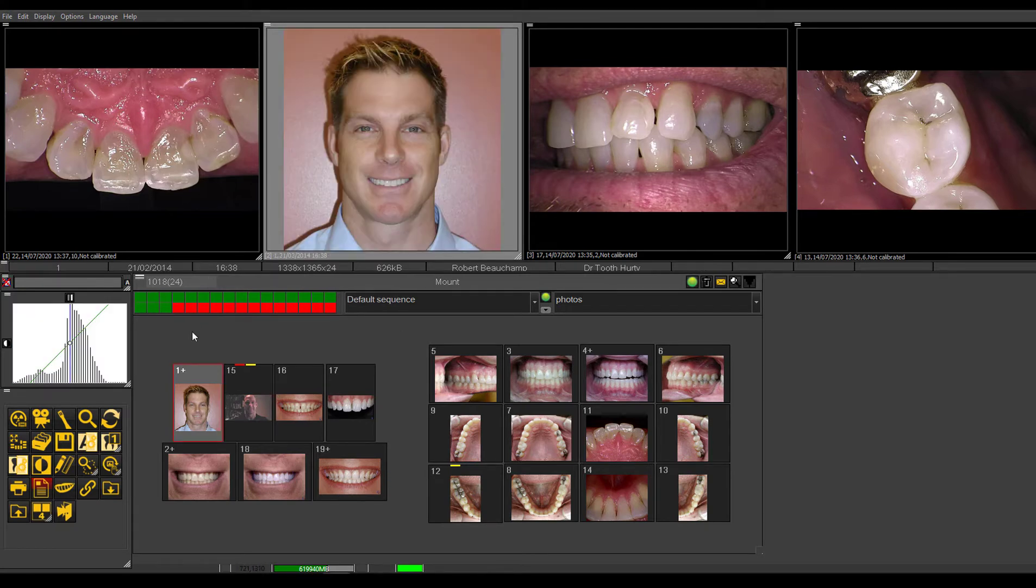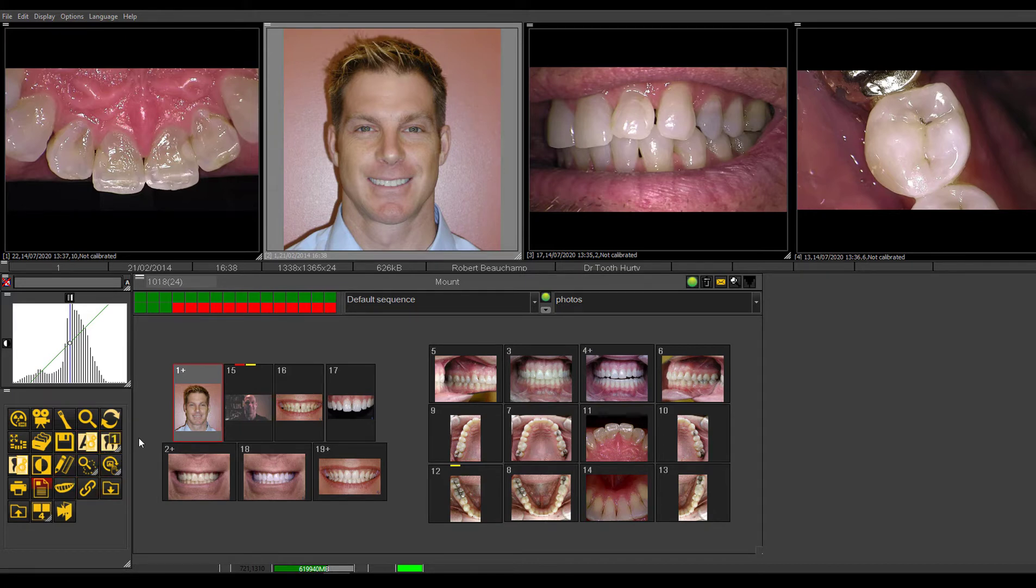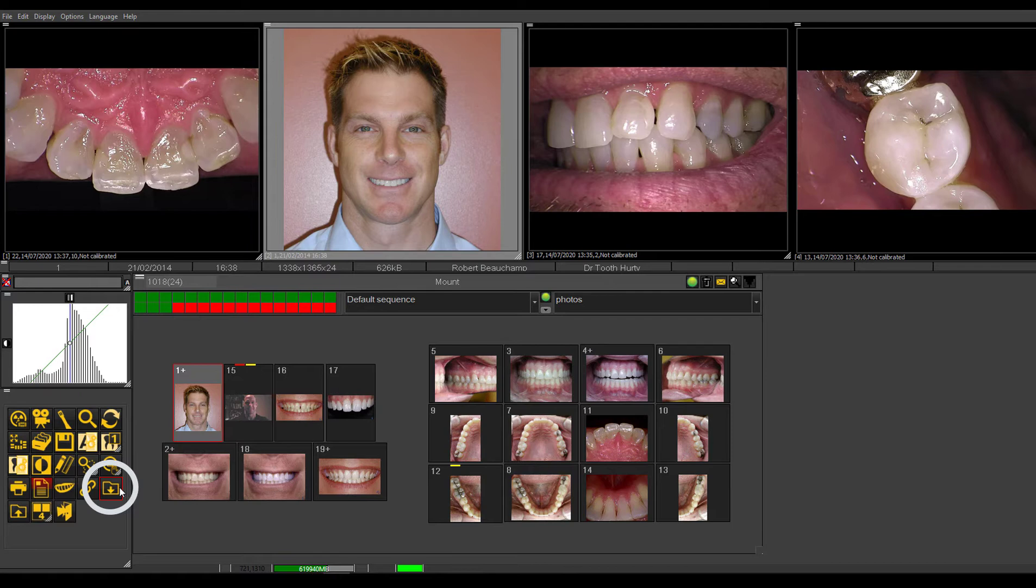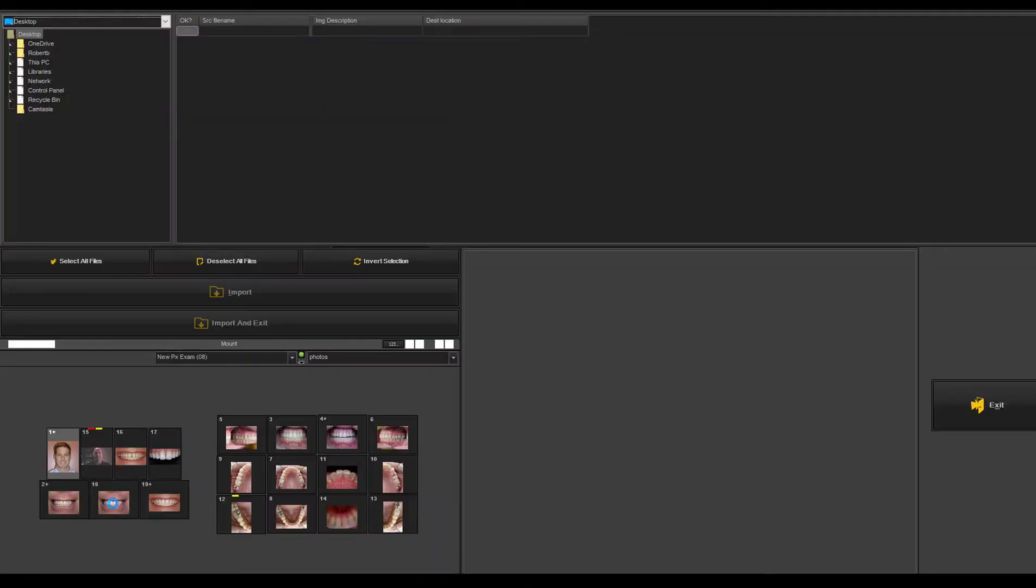What's nice is once you're into taking this type of protocol, when you do want to import the images into the software, you would just go to that station, plug in the camera or remove the memory card from the camera, plug it into the memory card reader, and then you would be able to import images by clicking on that icon.